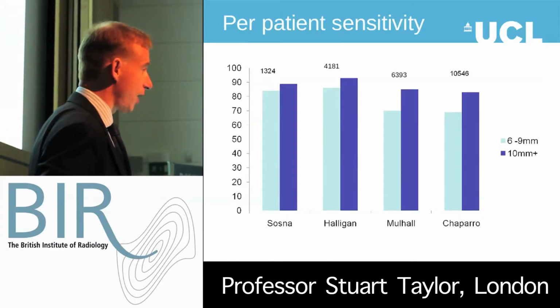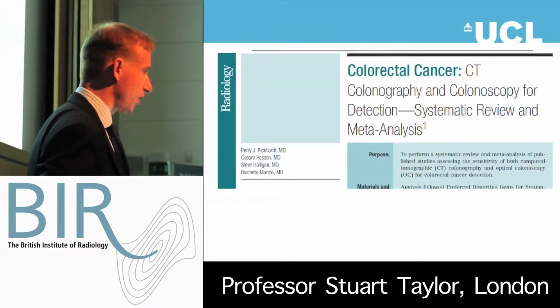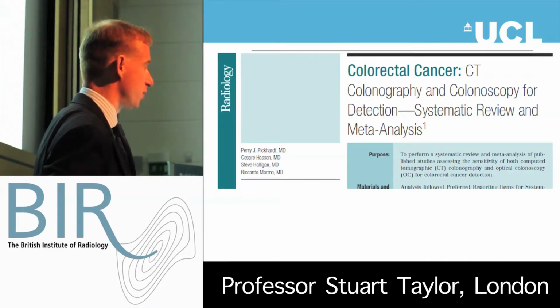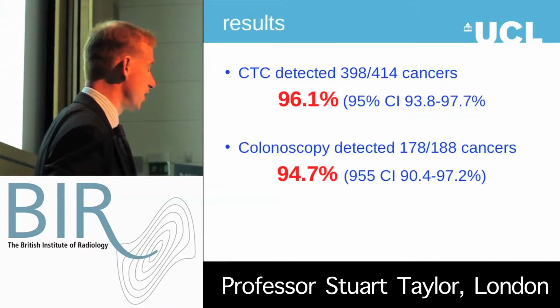For colorectal cancer, clearly our symptomatic work in the UK is very important. And quite recently, meta-analysis has been done for colorectal cancer. And again, reassuringly, CT's got a very high diagnostic performance, 96% sensitivity. So in fact, comparable to conventional colonoscopy.